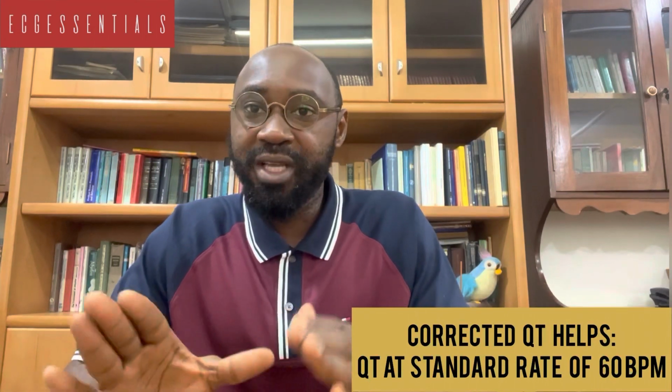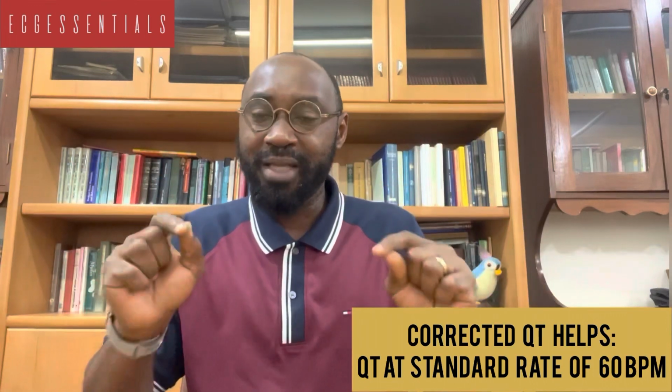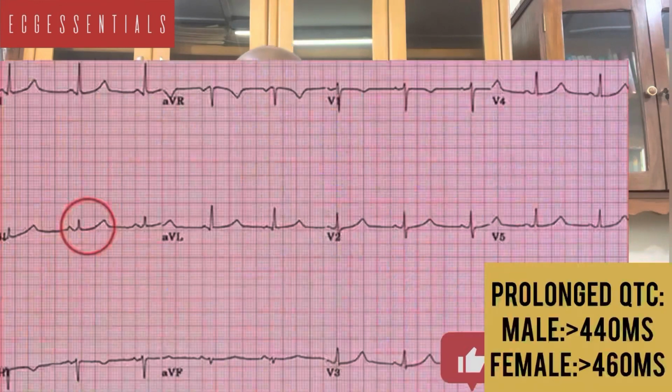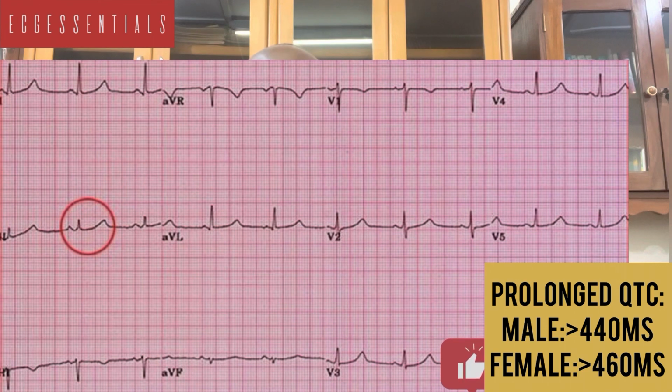And because of some of these variations and how they may affect standardized reading, we have the corrected QT interval, and that is a QT interval that has been corrected at the standard rate of 60 beats per minute, so that the reading can be uniform across. So we say a QTC that is more than 440 milliseconds in a male is prolonged. And if the QTC is more than 460 milliseconds in a female, we say it is prolonged.